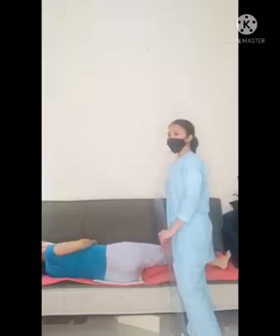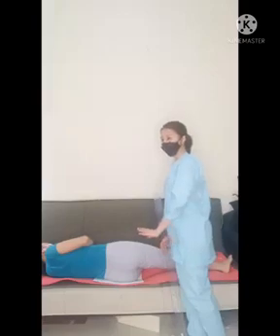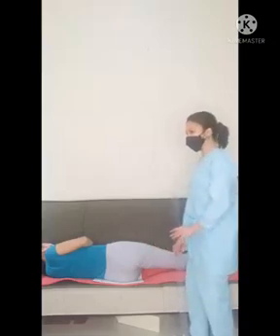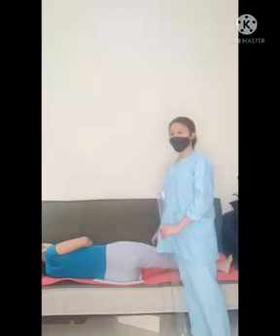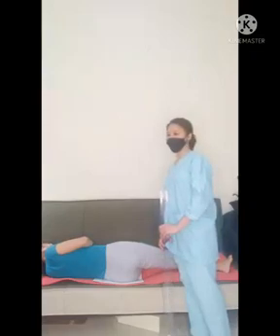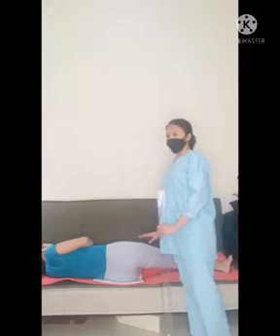then what we're going to do is, in the Lowenstein projection, the hip is located between the ASIS and pubic symphysis. The central ray in this projection is 20 to 25 degrees cephalad. So, the structures shown in this projection are the lateral hip, acetabulum, and proximal femur.